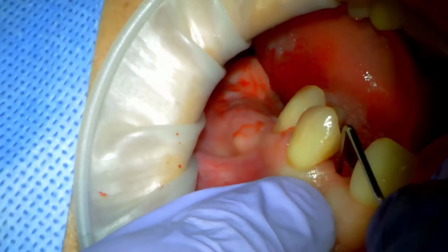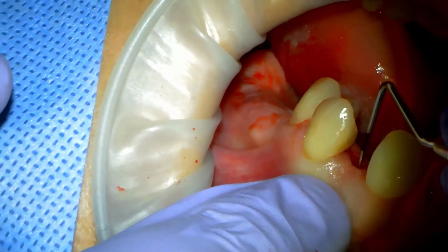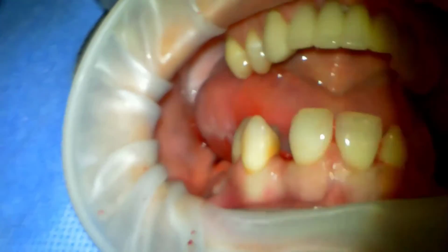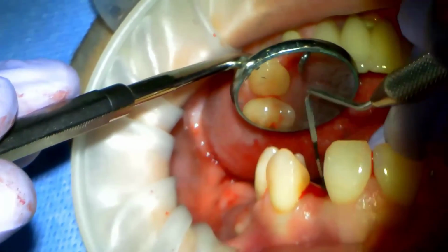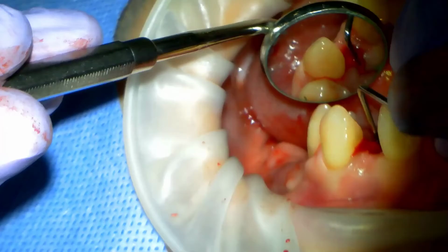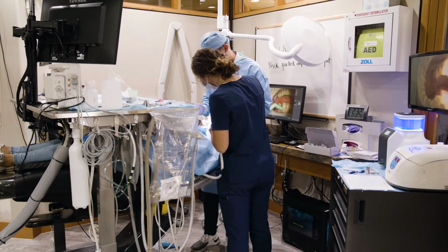Yeah, I like what I'm feeling there. That looks pretty good. Let's take a mirror and let me take a peek. Little thin on the palate. I think we kind of knew that. In the implant up, there is good bone around there though, so I like what I'm feeling there.